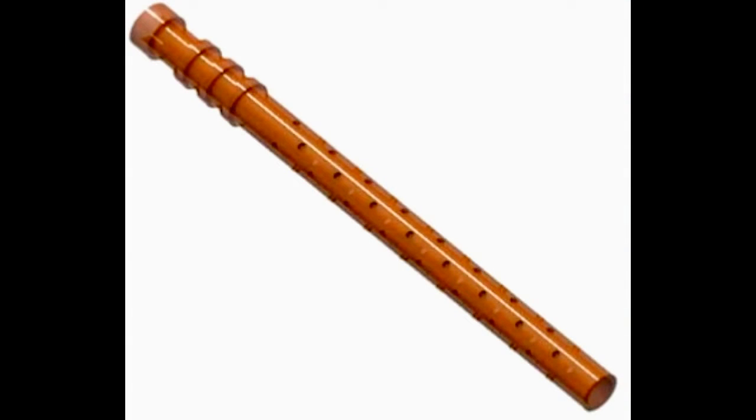The stent is 6.35 millimeters long and is made of a flexible polyimide material. The shaft of the stent has 64 fenestrations, which allow for the percolation of aqueous into the supraciliary space.